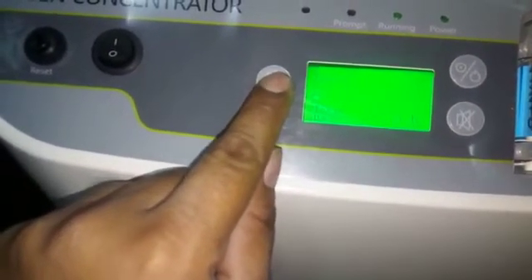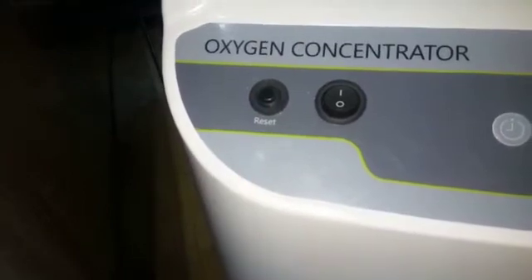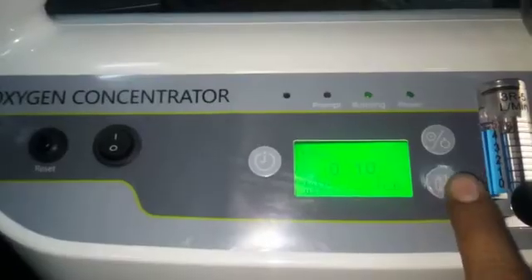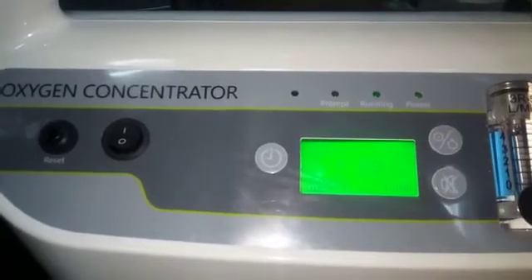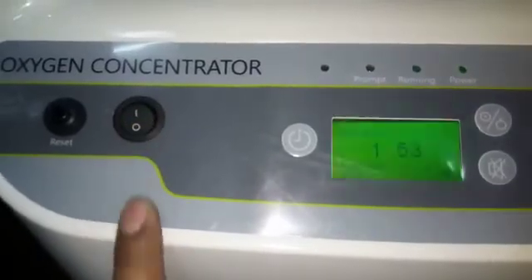We can adjust, and this is a reset switch. After heating up, it resets automatically, but we can also reset manually. This one is standby mode for two minutes, and this one is the off switch.